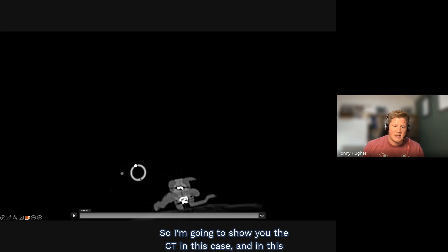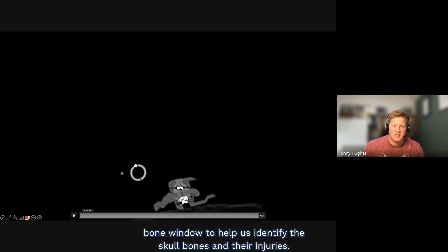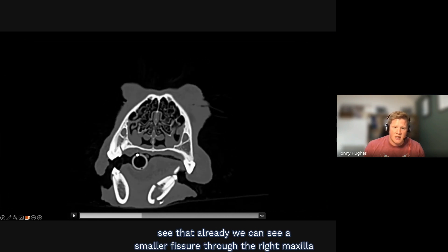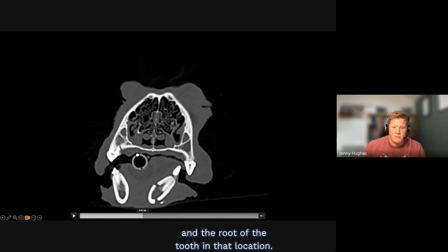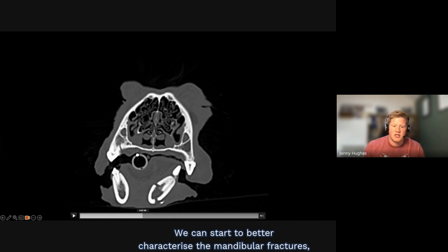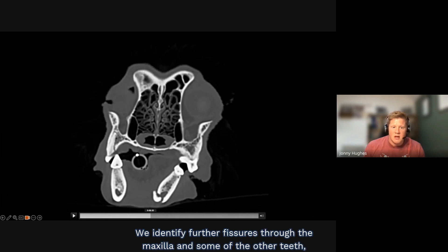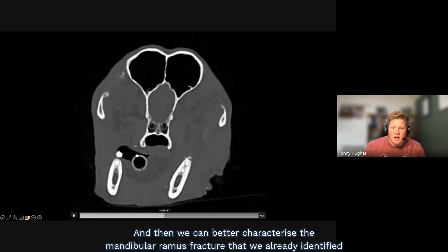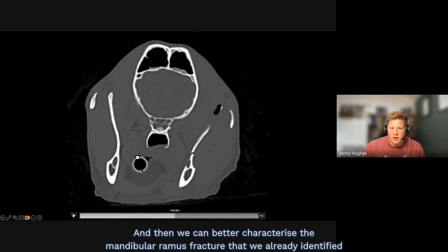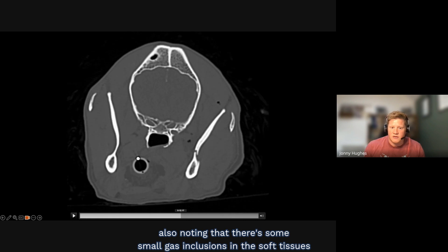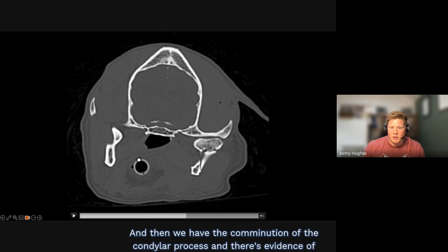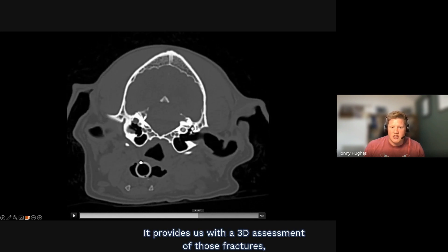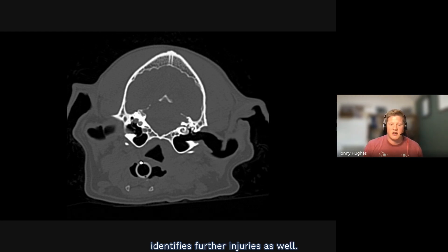The CT in this case uses a high-frequency reconstruction in a bone window to identify the skull bones and their injuries. Running through the head CT in transverse, we can see a fissure through the right maxilla and the root of a tooth, and we can better characterise the mandibular fractures, their orientation and displacement of fracture fragments. Further fissures through the maxilla and teeth are identified bilaterally. Small gas inclusions in the soft tissues suggest an open fracture, and there's comminution of the condylar process with communication of fracture lines to the temporomandibular joint. The CT provides a 3D assessment and identifies further injuries.